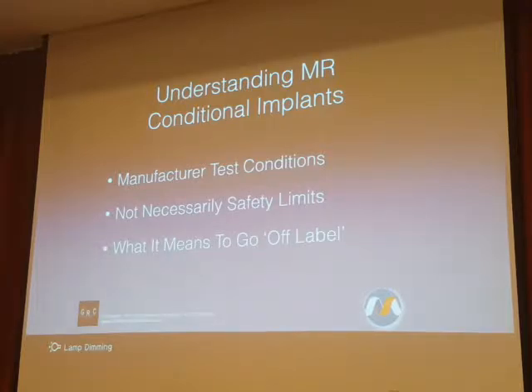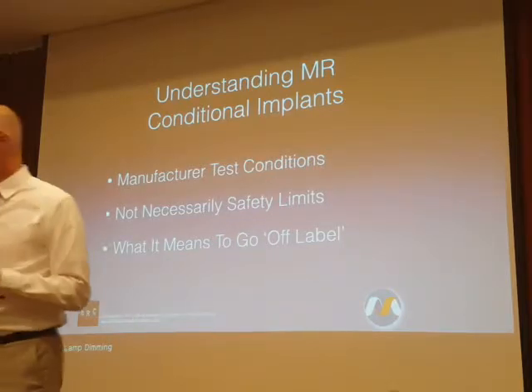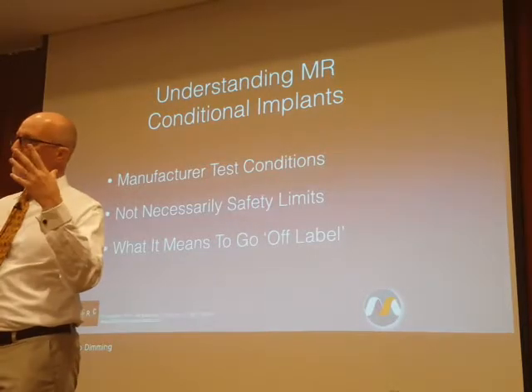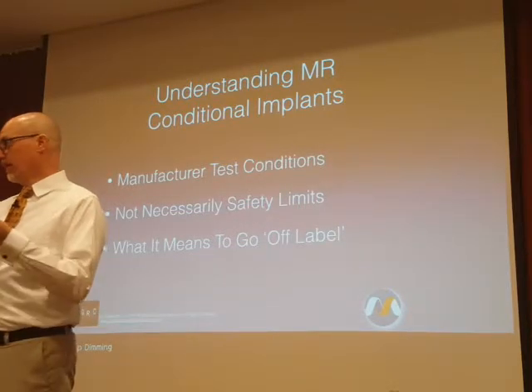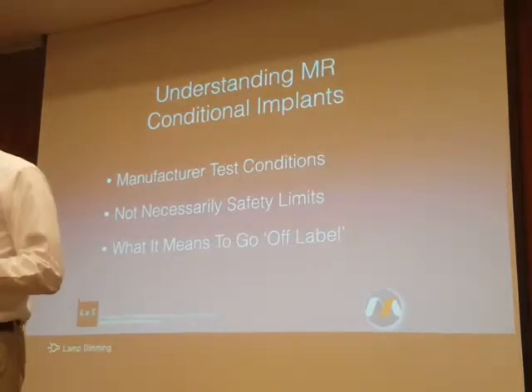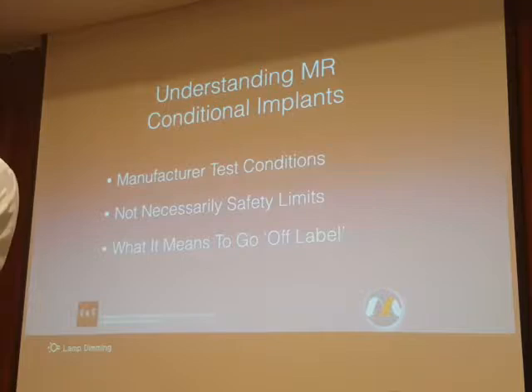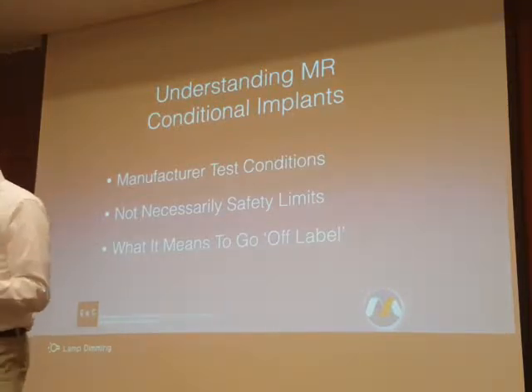There are CSF shunt valves. Some are magnetically activated, and when you expose them to the magnetic field, you can actually dial up or dial down the patency, the openness of the CSF valve, which can have negative effects on the patient. So yes, there are some where we need to verify prior to the study. We have to verify after the study. Pacemakers, ICDs, neurostimulators, there are many of them where we have to program them into a specific mode to allow MR imaging to take place safely.